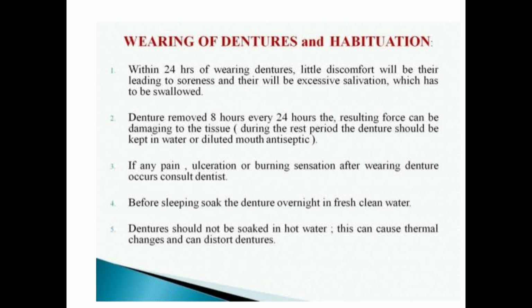Ask him to tell you what discomfort he is feeling, whether he is feeling pain, any overextensions, whether he cannot swallow water, or whether he cannot eat properly. So what problem is he facing? Ask him. Never tell the patient to use the denture overnight.